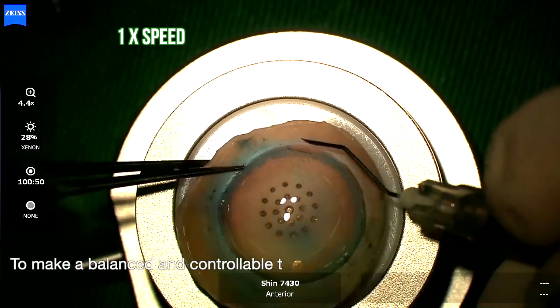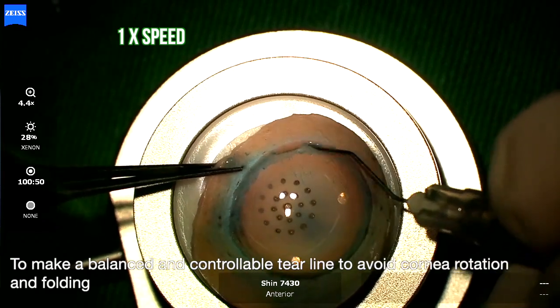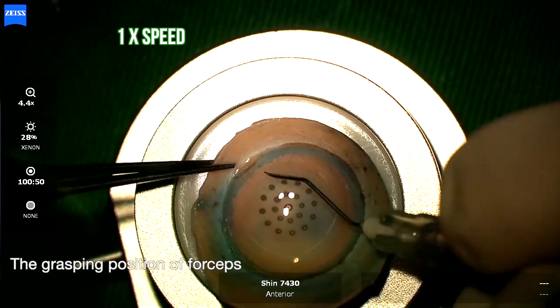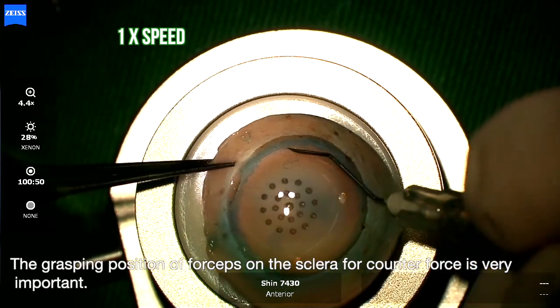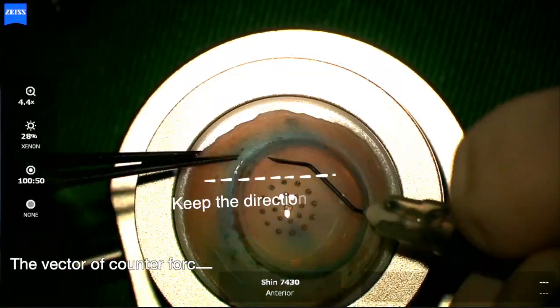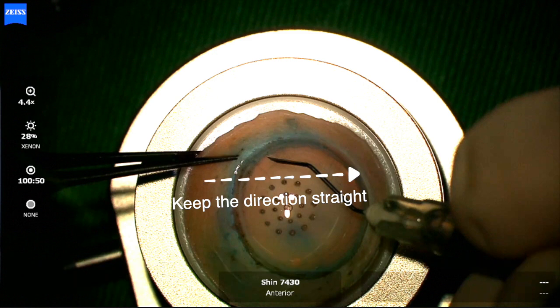To make a balanced and controllable tear line to avoid cornea rotation and folding, the grasping position of the forceps on the sclera for counterforce is very important. The vector of counterforce should be horizontal to the vector of the needle tip tearing the Descemet membrane.